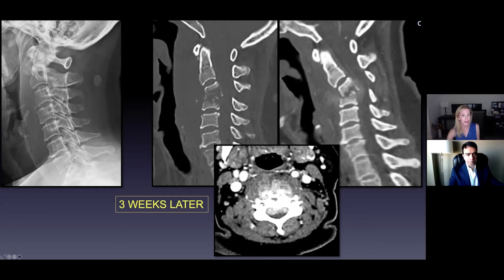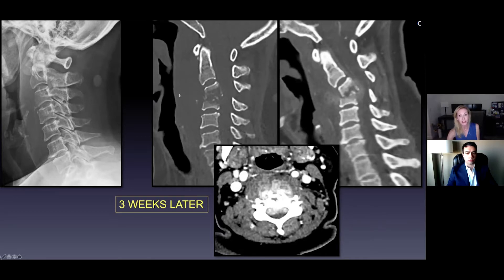Here at the C3-C4 level, these vertebral bodies no longer have normal height. This disc is gone — there's no longer normal disc space height, and it's not aligned anymore; it's not a straight line like it used to be. There is destruction and subluxation of the C3 vertebral body into the spinal canal, and we still see very prominent prevertebral soft tissues, which is very abnormal.